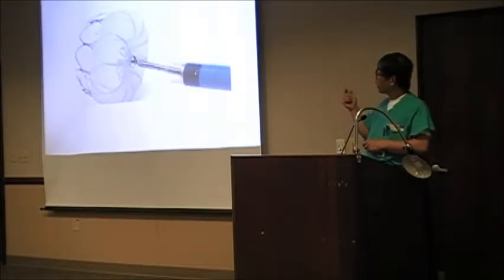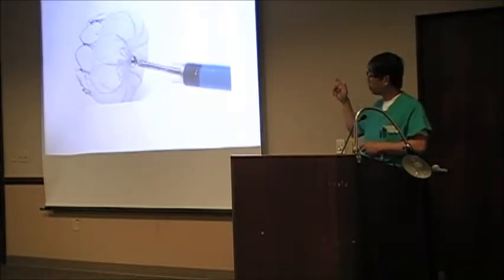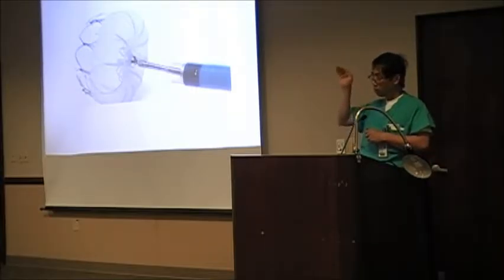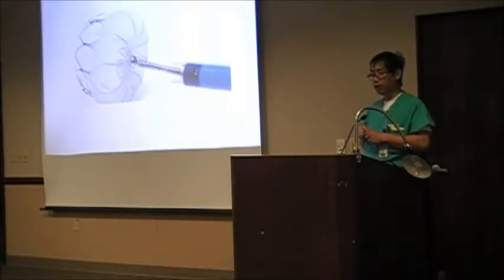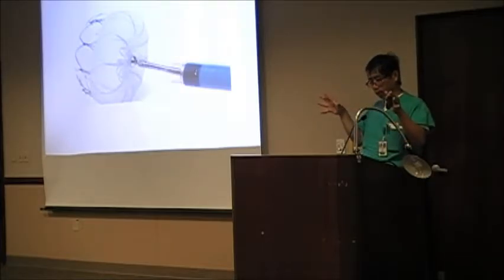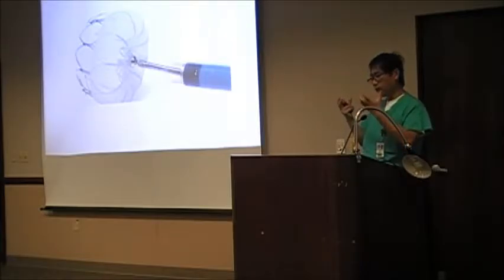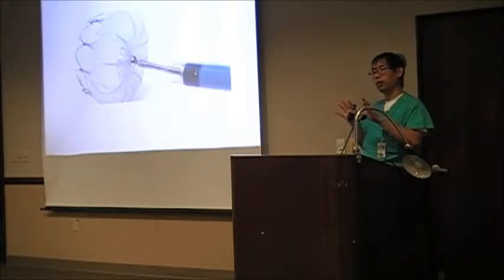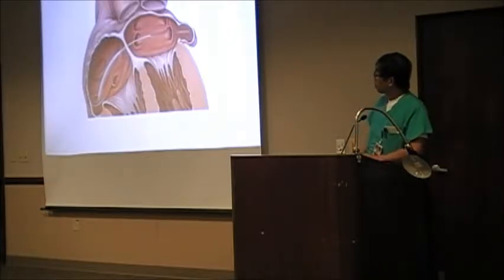I will show you some pictures to see how they do that. You put the catheter in, cross the wall from the right side, what we call the transseptal puncture, and deploy in the left atrium. You deploy this umbrella, and it has a hook in each area, and then they hook to the appendage tissue. Slowly the fiber will cover it, and they will occlude the device. So this is usually what they do.